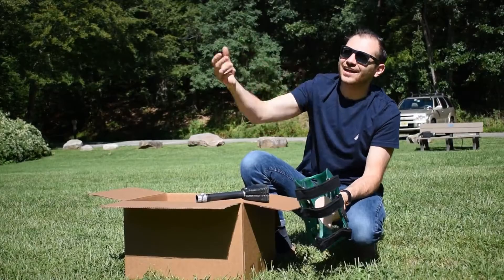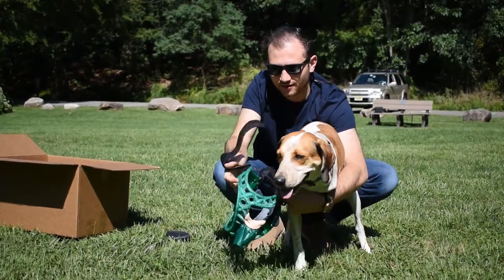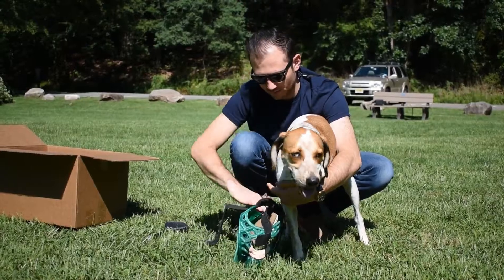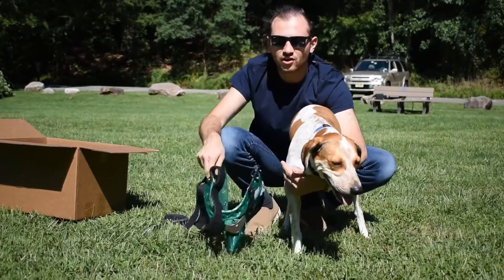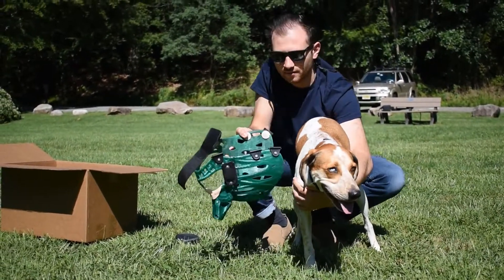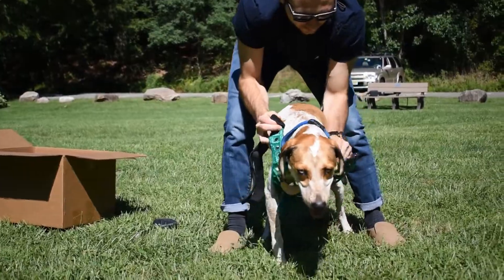I'm going to go ahead and undo our straps here and get Jack in. You might want to do this with two people — your dog may be nervous, so take it slow and don't feel the need to rush. There are also cases where you want to let them sniff this for a few days to really get comfortable being around it.